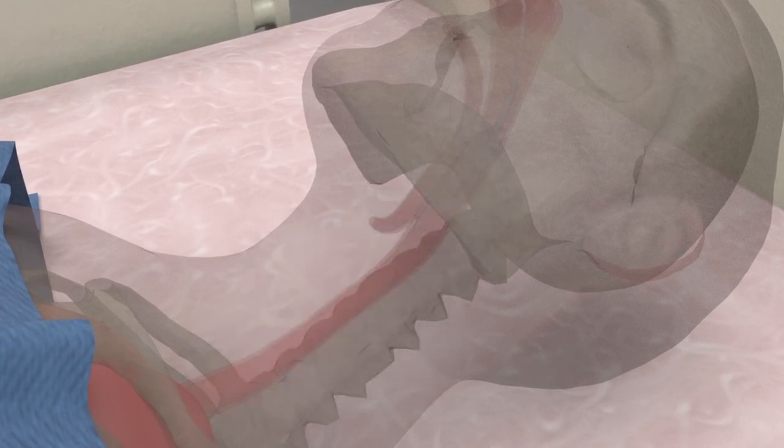It's the esophagus. Placement of a pressure monitoring device in this spot allows an accurate measurement of the pleural pressure and enables real-time calculation of the vital transpulmonary component.